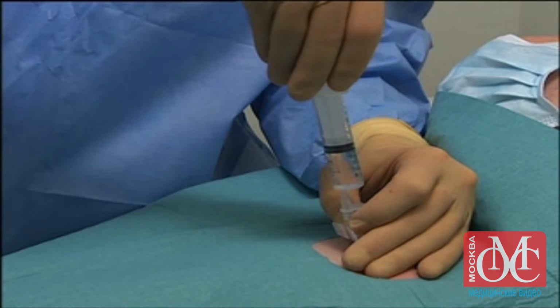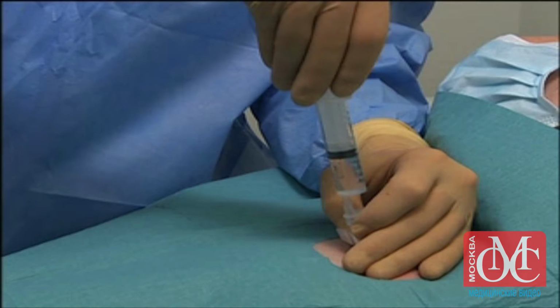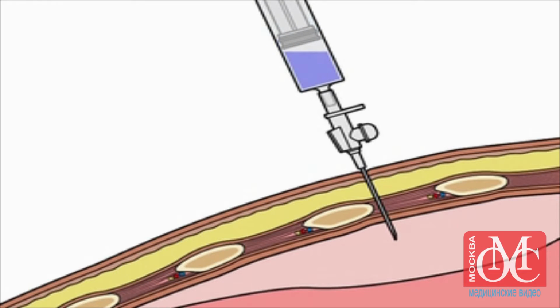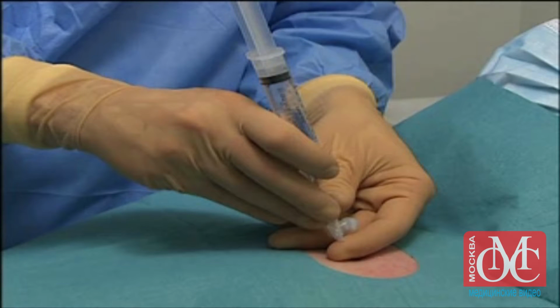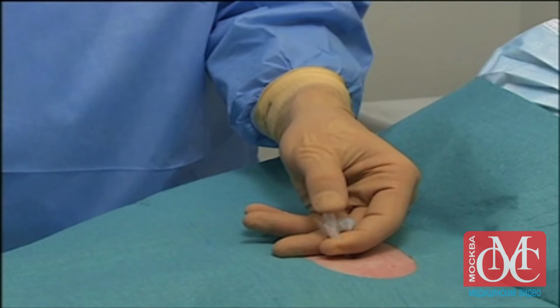At this point, move the needle forward a few millimeters to allow the catheter tip to fully penetrate into the pleural space. The appearance of air bubbles will confirm that the catheter has progressed into the pleural space. Ask the patient to exhale or cough to prevent air from being sucked into the pleural cavity. Remove both the catheter needle and the 10 milliliter syringe. Immediately cover the opening of the catheter with your finger to prevent the entry of additional air into the pleural cavity.